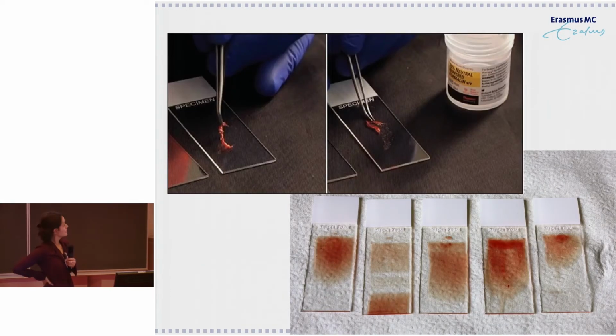So do you think these are different smears? Do you think there's one good smear? What is the perfect one? I think that one is good. And these are too thick, actually. The material is not dispersed equally and too thick.